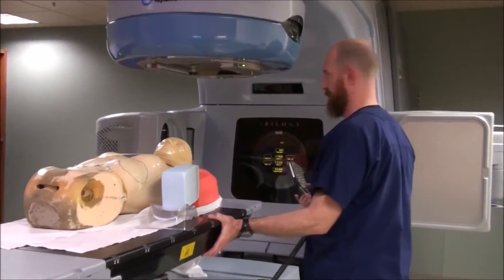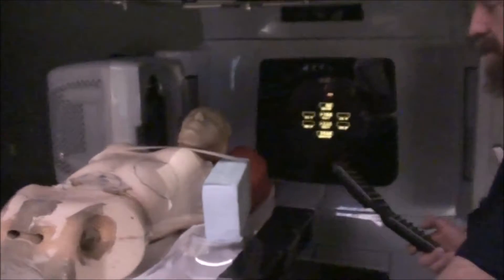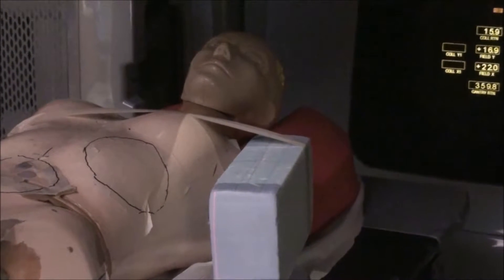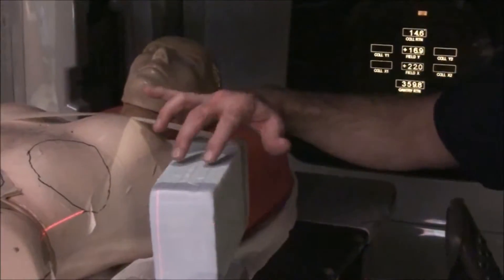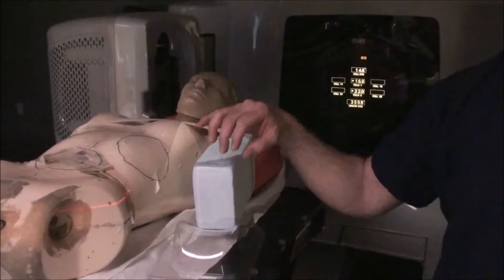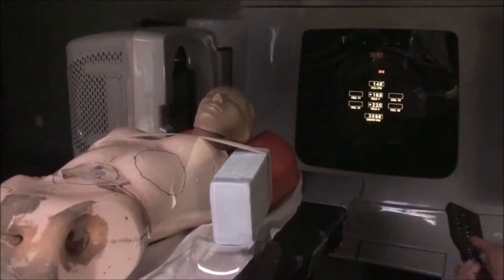We're going to go ahead and run this patient in and ballpark them. What you want to do is get the CR kind of in the middle of the arm where you're going to be treating, and then turn the collimator to approximate the same angle the arm is running. On most people you can palpate, but gently — if they've got a bone met, you don't want to be poking around too much. You can palpate where the humerus is, because depending on how the arm is placed, the skin and musculature can lead you to not really see exactly where the humerus is. In this particular case, the styrofoam is easy to see.